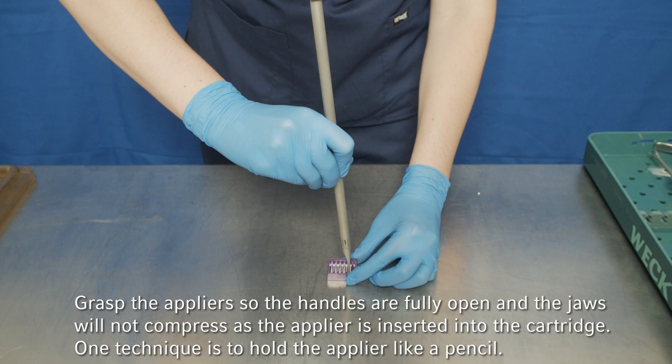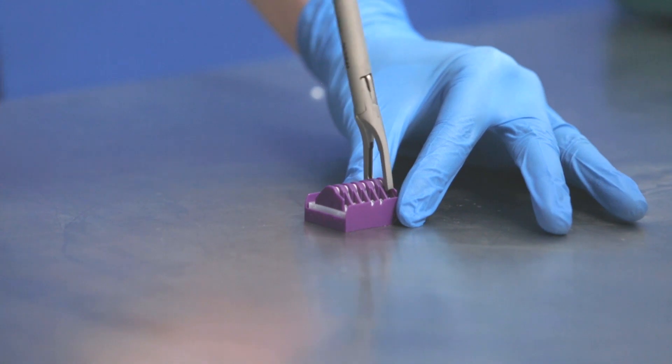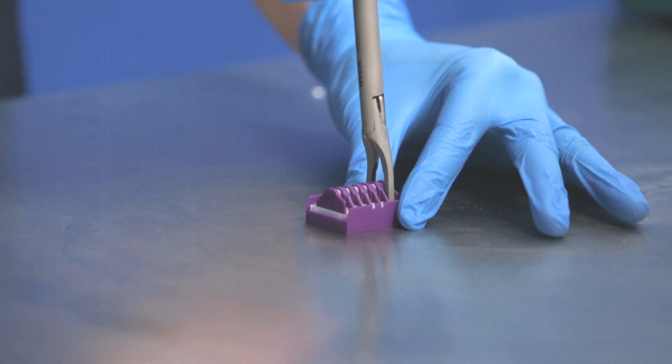One technique is to hold the applier like a pencil and make sure the jaws are perpendicular to the cartridge, then slowly and firmly push down. An audible double click will be heard when the clip is loaded.